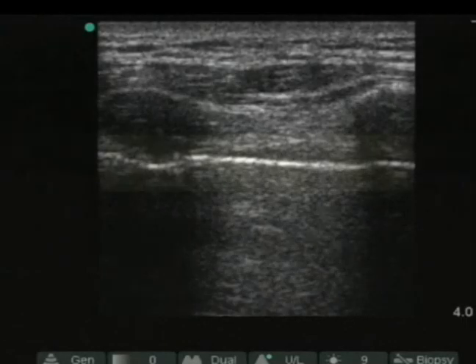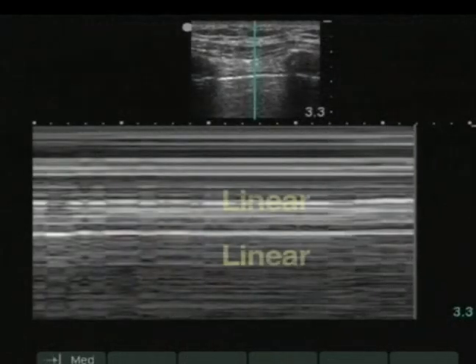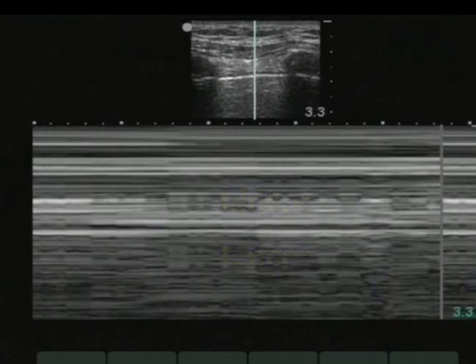In a patient with a pneumothorax, no pleural sliding or comet tail artifacts are seen. The M-mode tracing exhibits the same laminar linear pattern at the pleural line and beyond as seen in the stationary chest wall. This positive M-mode exam is sometimes referred to as the stratosphere sign.